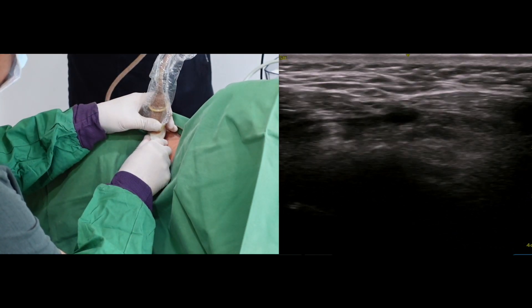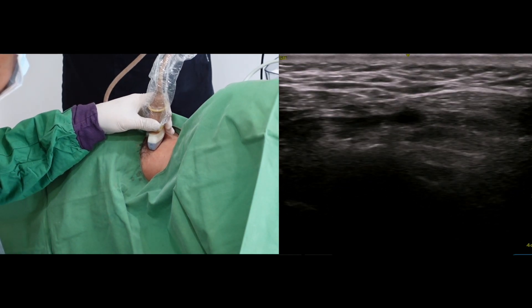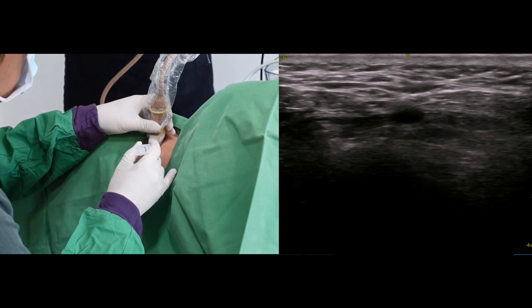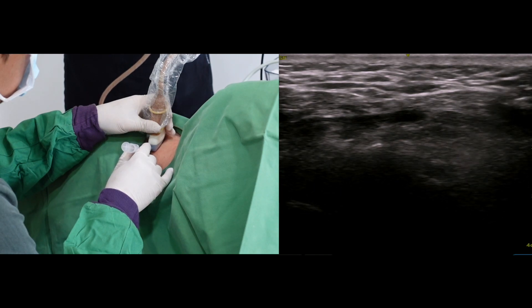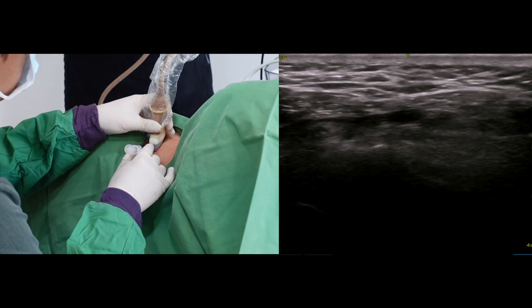Next, I will move on to the C4-5 facet joint. I may go to the same target repeatedly, so point to the previous needle puncture site on the skin and maintain the ultrasound probe alignment.